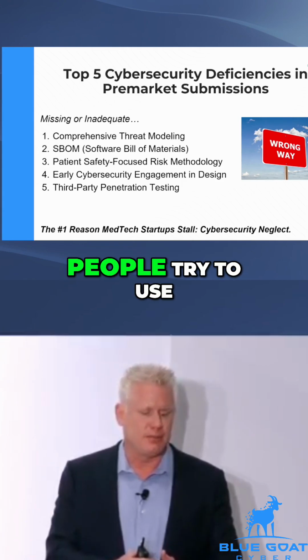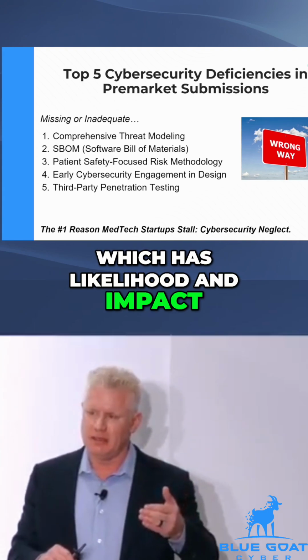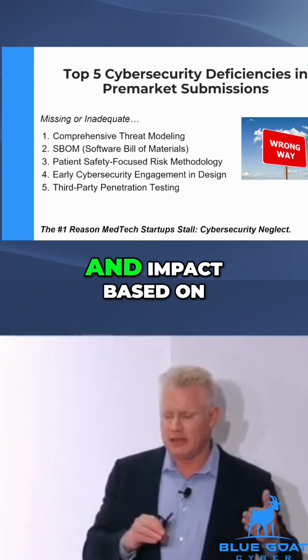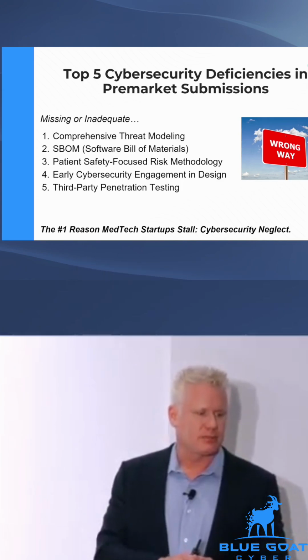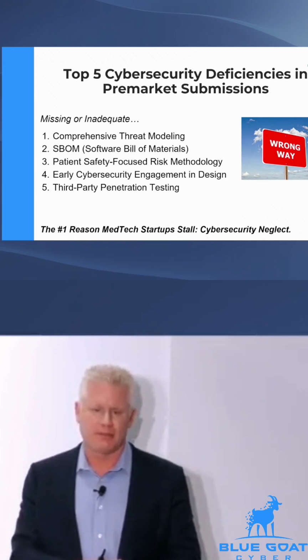And a lot of people try to use a traditional risk methodology, which has likelihood and impact. That is not what the regulatory authorities are looking for. They're looking for exploitability and impact based on impact to the patient. Exploitability is more of an objective measurement versus subjective.